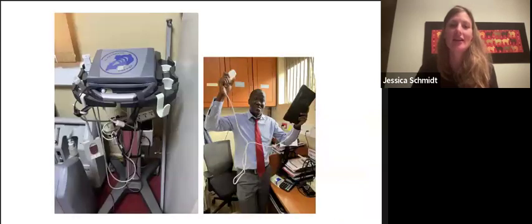Married to any of machine, and I'm sure everybody has an old machine that radiology used to use and now they don't use, and it's stuck in a closet somewhere and you can't move it, and that's the machine you use. But I think with these smaller, more portable machines, there's a lot of advantages.